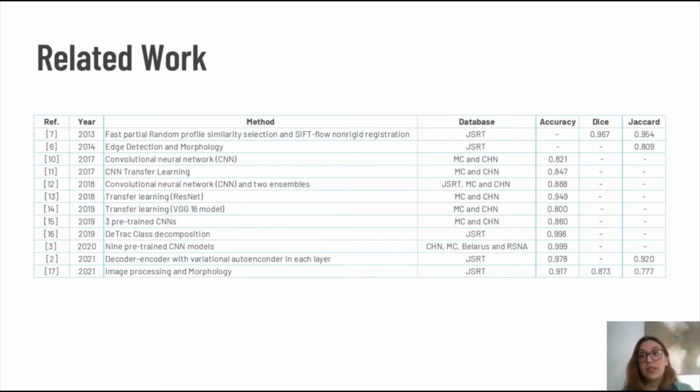There are several studies that automatically detect our region of interest on CXR images, mainly using variations of convolutional neural networks, and in those studies, limitations highlighted by the authors include the amount of time for training their models and the necessity of powerful machines. Another challenge faced by such studies is the necessity of a high number of images pre-evaluated by a specialist.